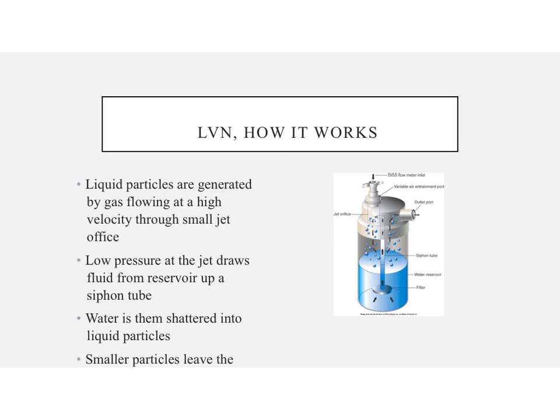Are the particles being generated monodisperse or heterodisperse? So these particles would be heterodispersed because they are all different sizes. The nebulizer isn't going to make one size of particle.